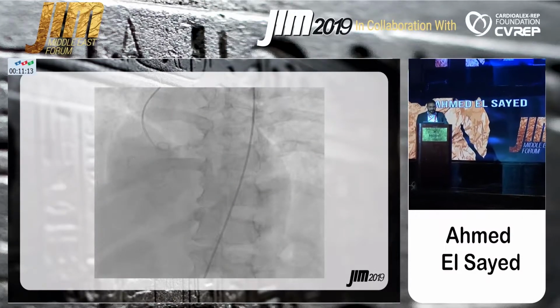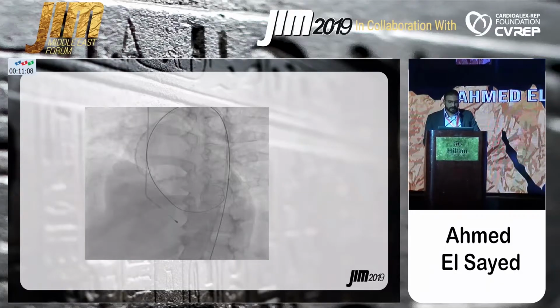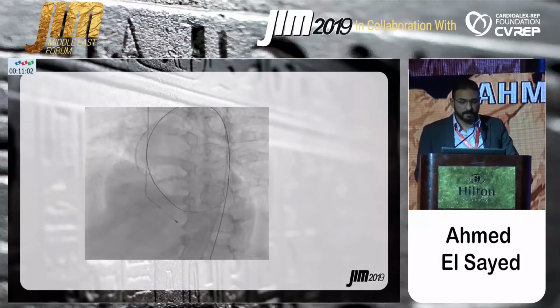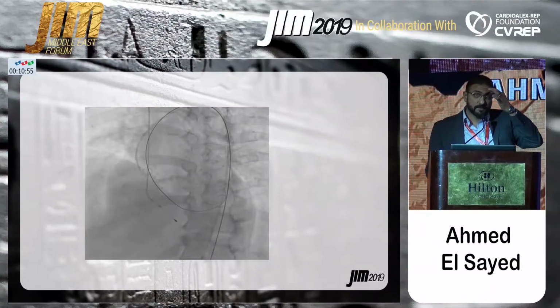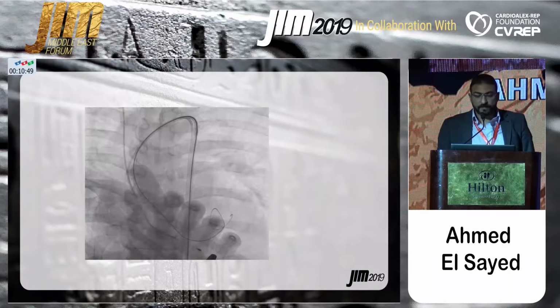So we did aortic angiography with a pigtail, and then we crossed the aortic valve and the stiff wire was placed in the left ventricle. At that time, we were planning to do TAVI with a Sapien XT 26 according to the aortic annulus measurement. We passed the balloon.